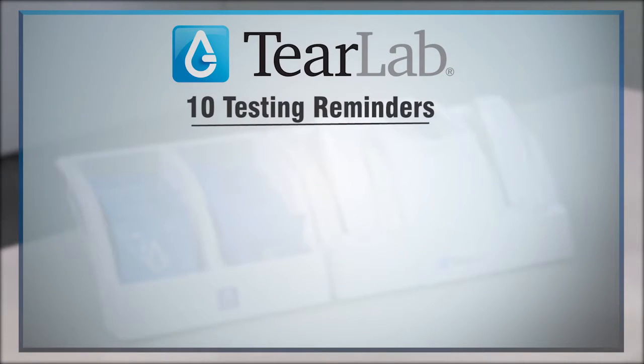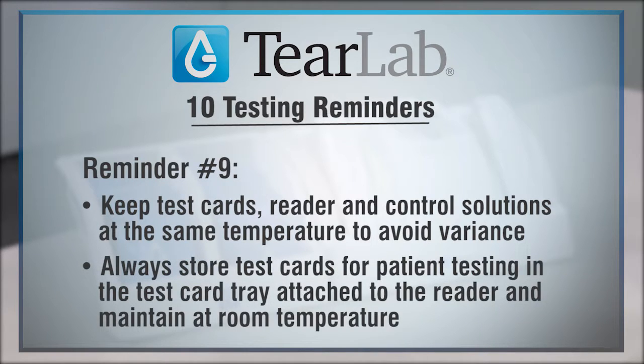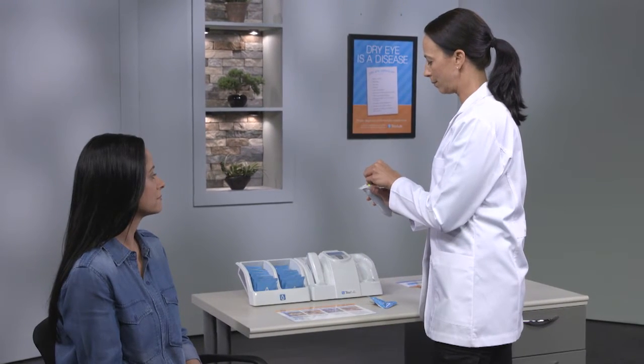Reminder number 9. Keep test cards, reader, and control solutions at the same temperature to avoid variance. Always store test cards for patient testing in the test card tray attached to the reader and maintain at room temperature, which is between 68 degrees and 77 degrees Fahrenheit or 20 to 25 degrees Celsius. Temperature affects the osmolarity calculation when a test is performed.